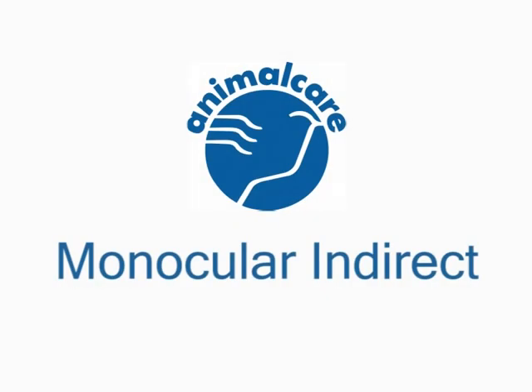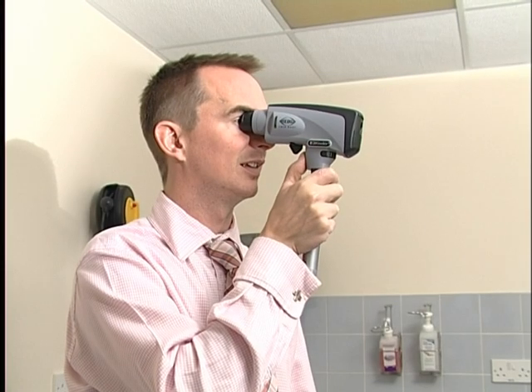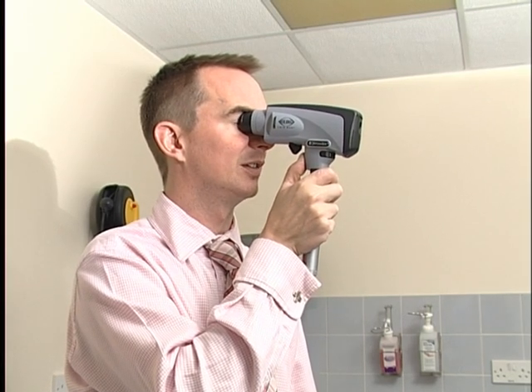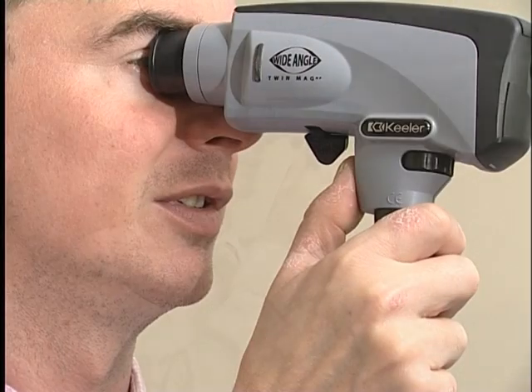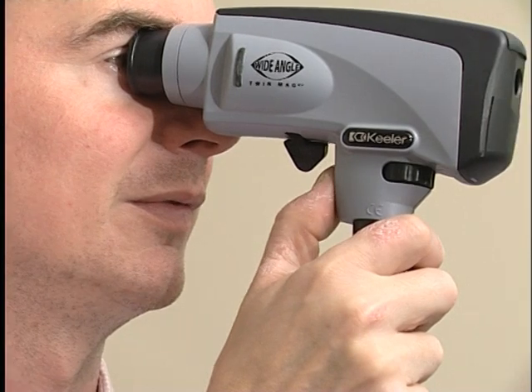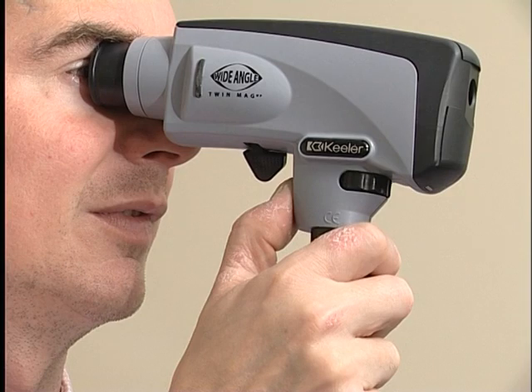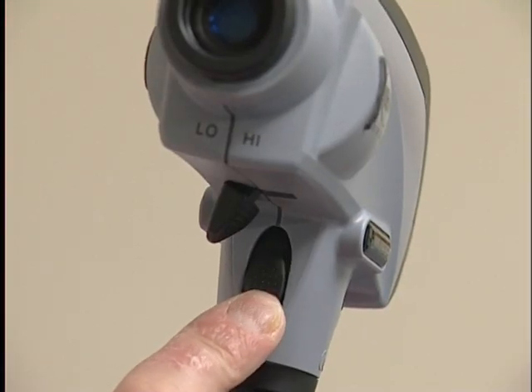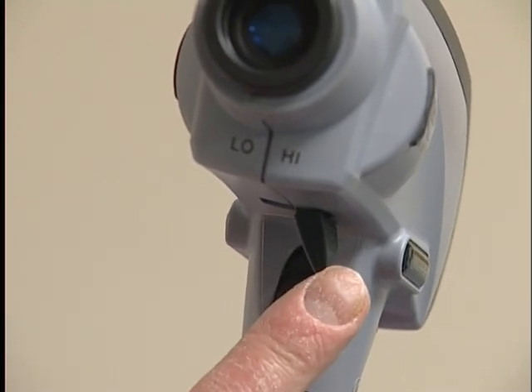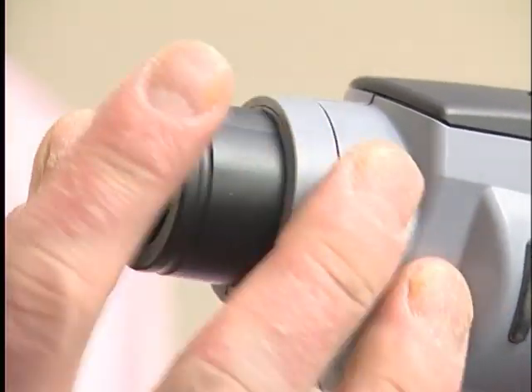The final technique for retinal examination is to use a monocular indirect ophthalmoscope, such as the Keeler wide angle. With the wide angle ophthalmoscope, it's important to set the instrument up prior to usage. There is a focusing diopter dial, and in order to set this, look through the ophthalmoscope at a distant object and move the slider up and down to get the image in focus. There is a magnification dial for low resolution and high resolution, and on the handle there is a rheostat for light intensity. The eyepiece tube should be extended for non-spectacle wearers.